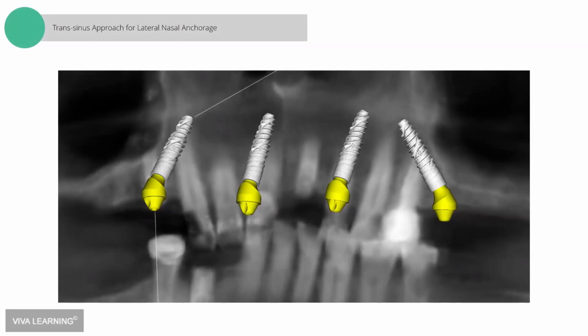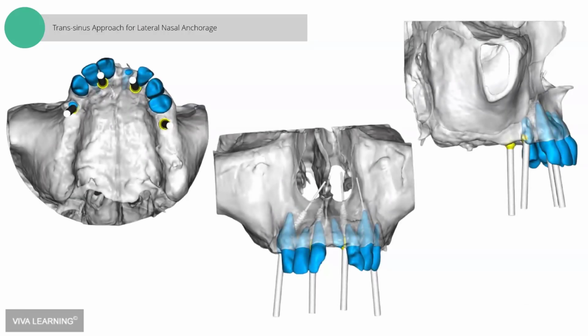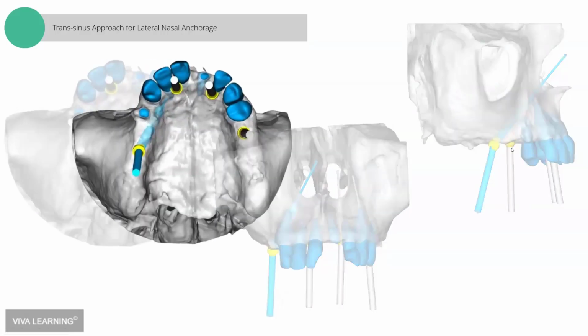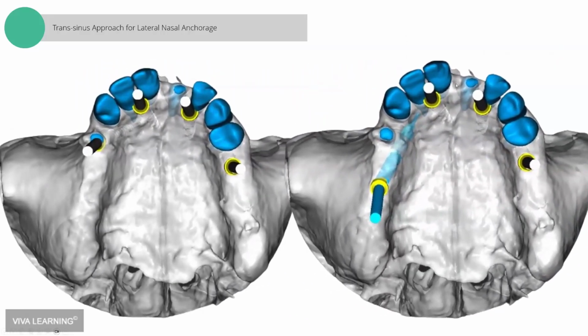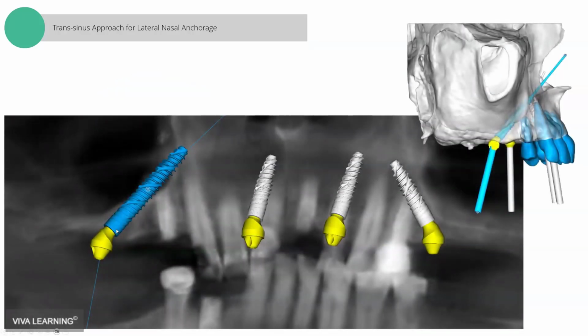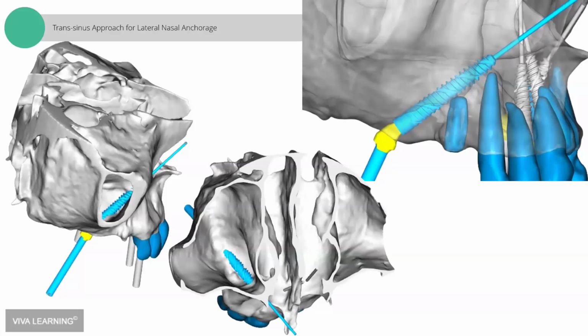One last case I'll show you, a more advanced all-on-X technique on the maxilla. If we have a person who has a very large sinus, like we see here on the upper right, the spread of our implants can become detrimental to us. We don't have as much; we're only here at the first premolar versus the second premolar. Whereas we can plan a longer implant that's called transsinus and allows us to actually go through. With these models, we can get a very accurate representation of what that's going to be like and plan our surgery for something like this that not only goes through the sinus but re-engages the lateral nasal wall. Having this kind of model printed in hand, you can even do the surgery on the desktop first with some dummy implants, which is really convenient.